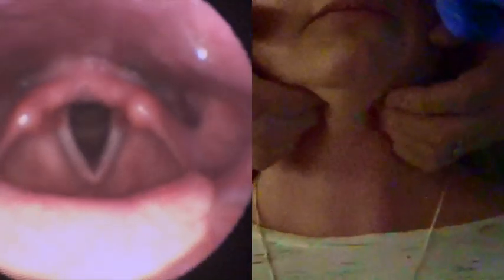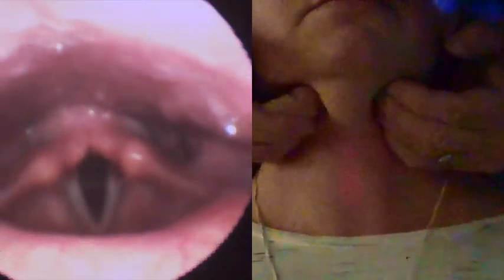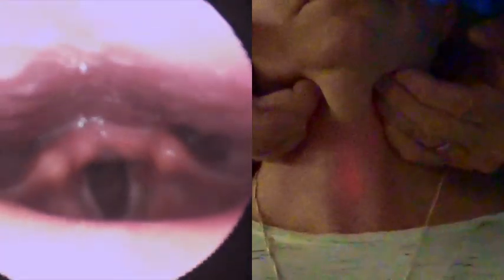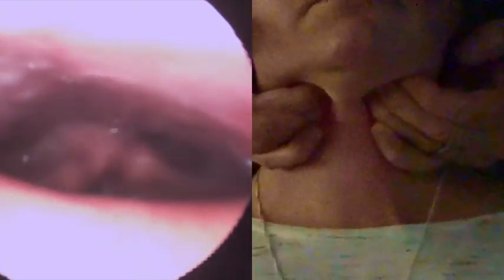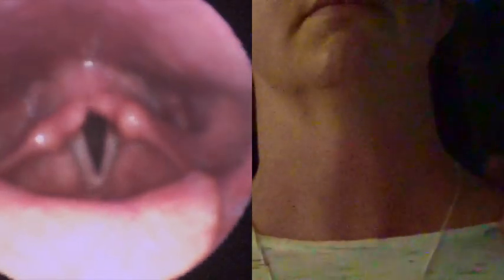What if I went to where we were earlier? Now, that had an immediate impact on the arytenoids. When I came up and under, this was sort of that second portion of when we were at the base of the tongue, compressing. And as if I reach down, elevate the entire larynx via the submental region, right there. Does this feel useful at all? A little bit. A little bit, got it. So we would go back, where would I spend my time? In the places that she felt connected to, all right?